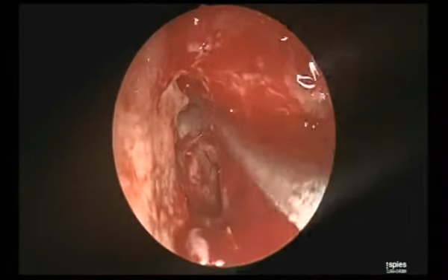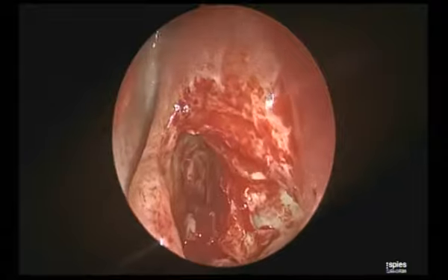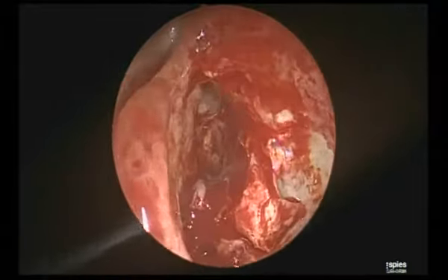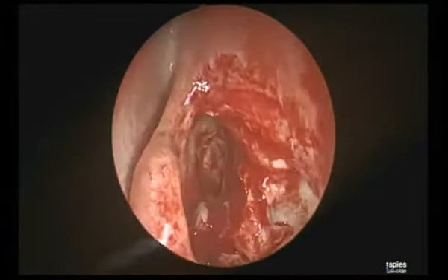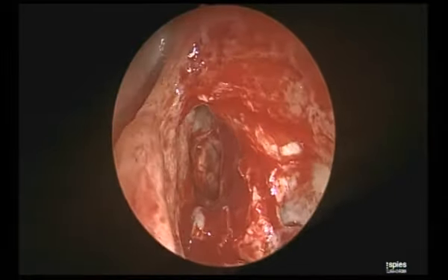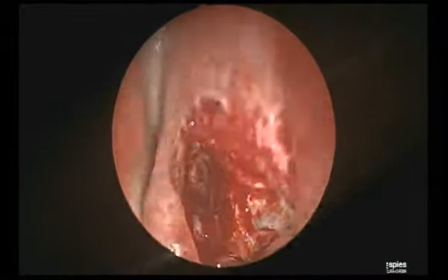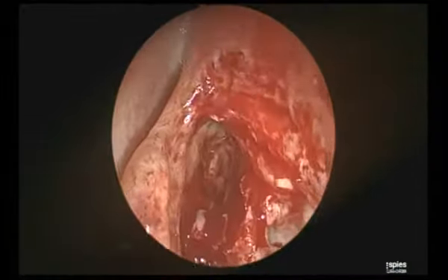I believe this will be more relevant in revision cases. See, I have done so many revision cases that the only landmark you will always find in this region is this. You may have the middle turbinate out, you may have the lamina deficient, you may have the bulla gone, skull base not identified, everything. The only landmark which you always see is the nasolacrimal system and the beak.